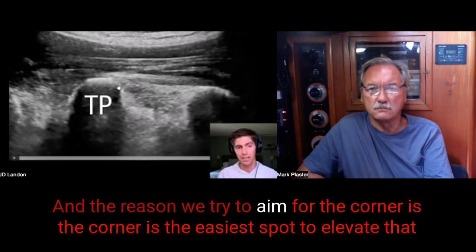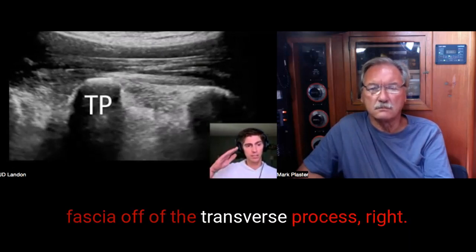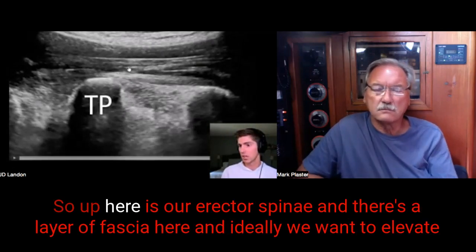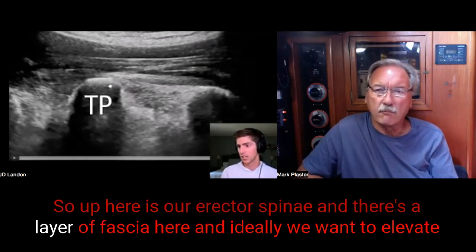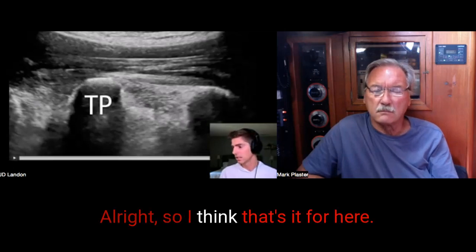And the reason we try to aim for the corner is it's the easiest spot to elevate that fascia off of the transverse process, right? So up here is our erector spinae, and there's a layer of fascia here, and ideally we want to elevate it off the corner or the tip of the transverse process so that it runs all along the spaces. All right, so I think that's it for here.